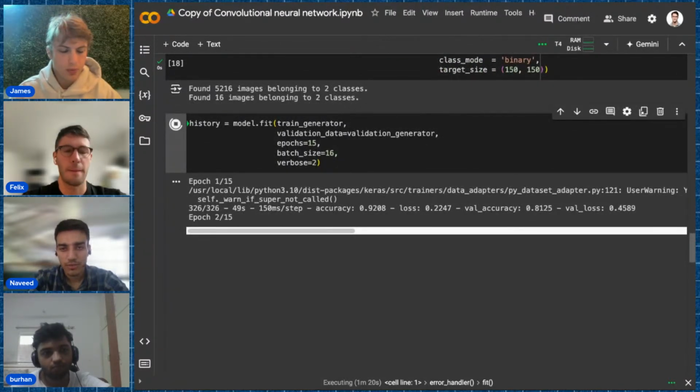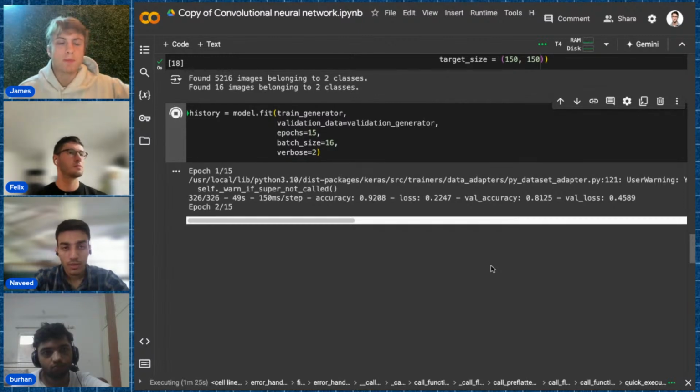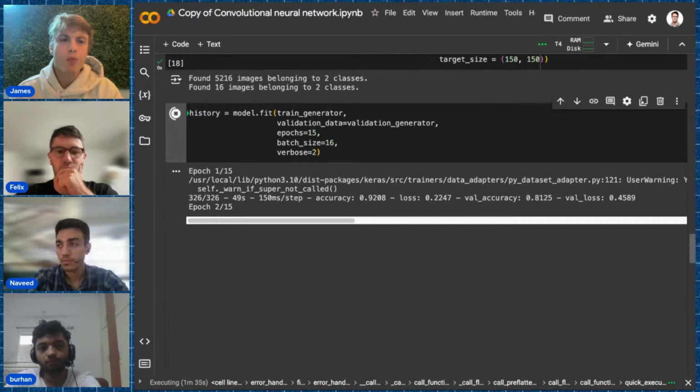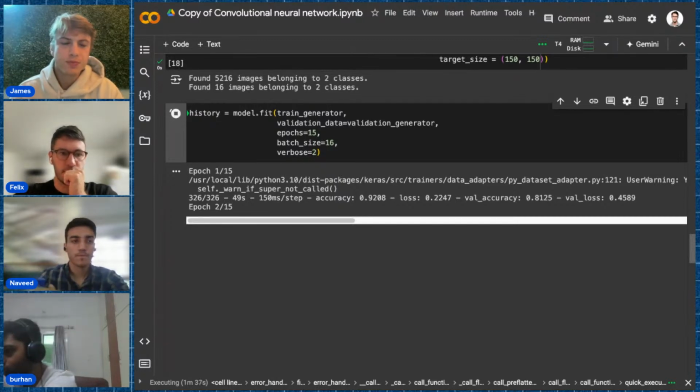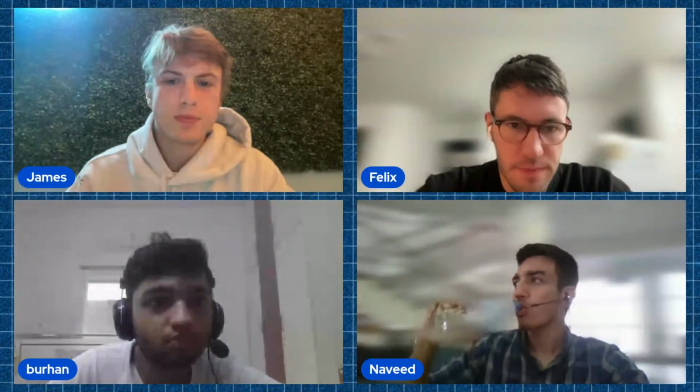Validation accuracy is 81. Training accuracy is 92. Maybe Burhan can present his project till this training finishes. What do you think, James? Sure, that would be great. All right, perfect. I'll stop my screen sharing.